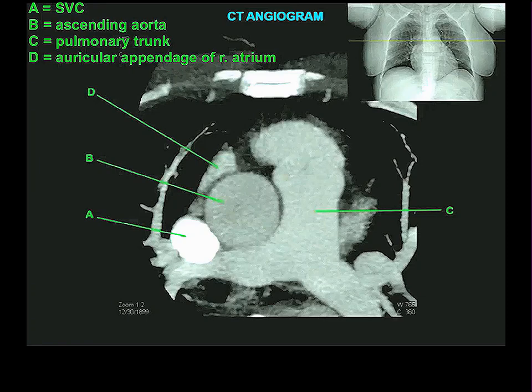Used to be that to see a person's coronary vasculature, you had to put a catheter through their femoral artery and up through the aorta and inject contrast right into the coronary vessels. Now, you can just do a regular contrast CT, and the resolution is so good, and the ability to see things magnified is so great that you can actually see the coronary vasculature. So it's a much easier study to do, and it can be done on almost anybody. It's called a CT angiogram.